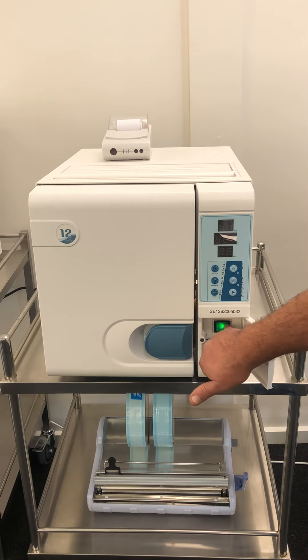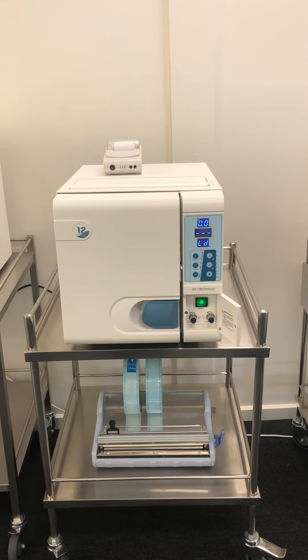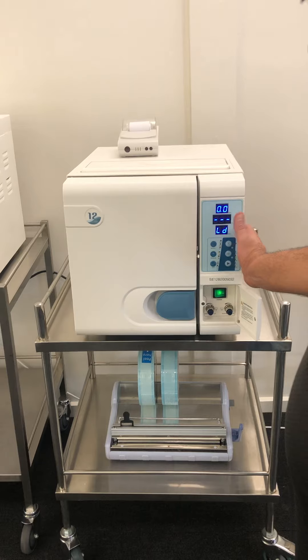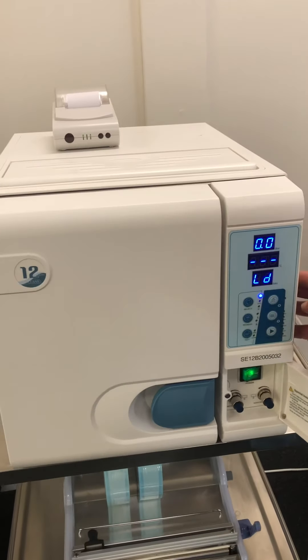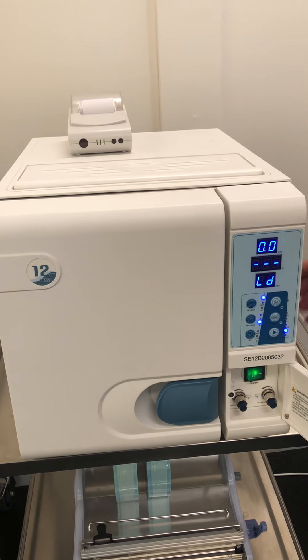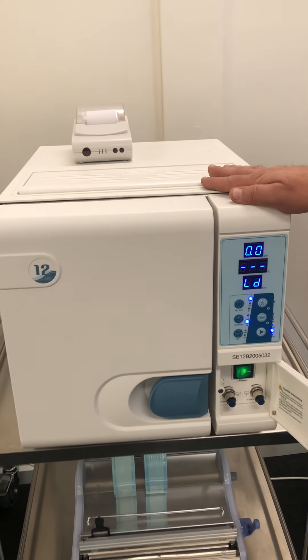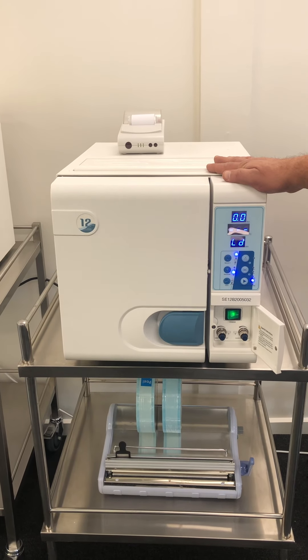Going back to the original — the main one that everybody uses in the beauty industry. You've got your instruments inside, you've got your water there: 134 degrees, packaged, then start. This cycle should run between 30 and 35 minutes and it's a very simple process.